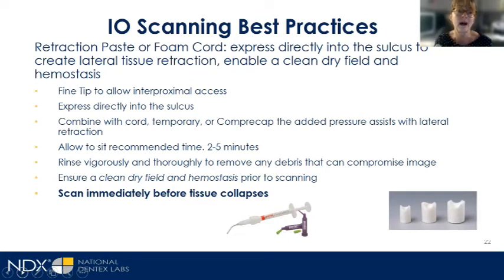So a fine tip on the applicator is really important. However, the finer the tip, the more difficult it is to express it, to squeeze it out of the applicator. So it might take a little time trying a couple different brands before you find one that works really well in your hands. In combination with retraction paste, I very much like the Compra Caps.